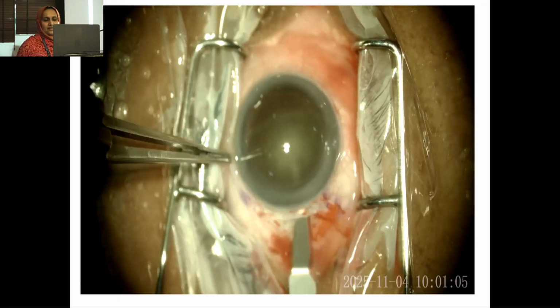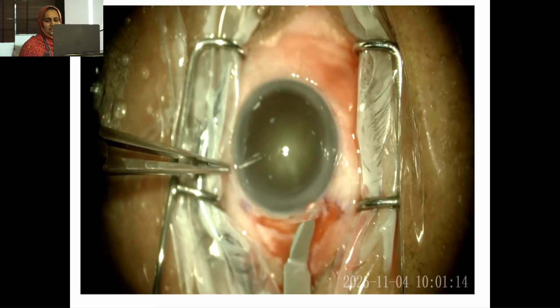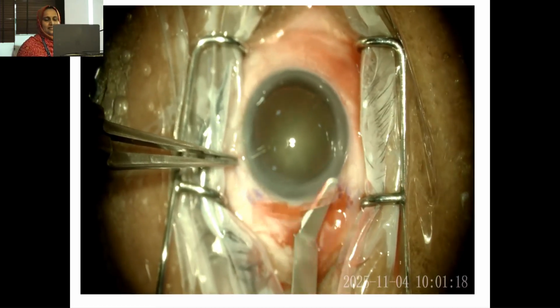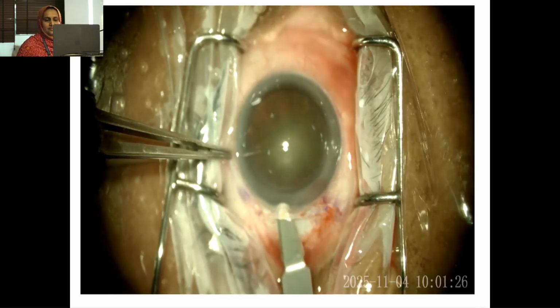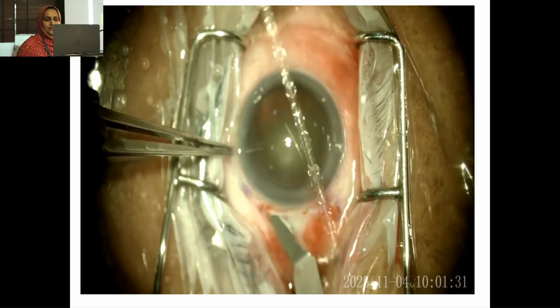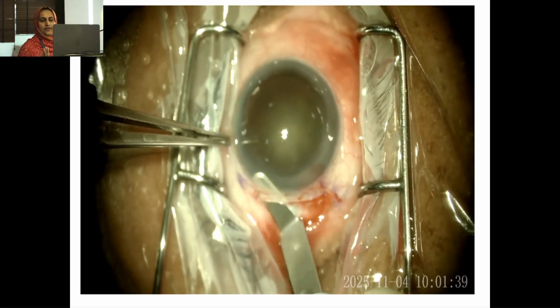Then the crescent blade makes a gentle wriggling movement as you make the tunnel. The tunnel should be uniform in thickness, and the visibility of the crescent helps in deciding the depth of the tunnel. As you extend on either side, you should also keep in mind the contour of the globe. When you enter the cornea, the heel should be down.